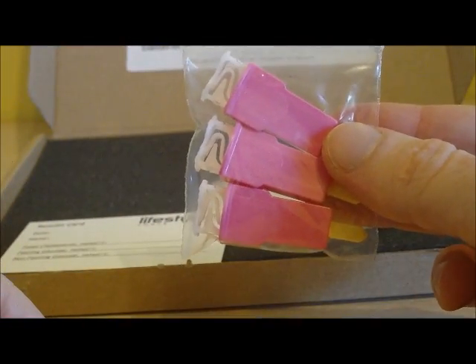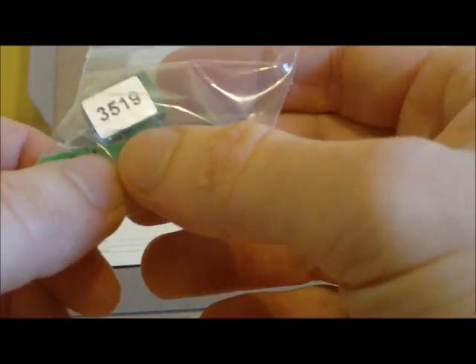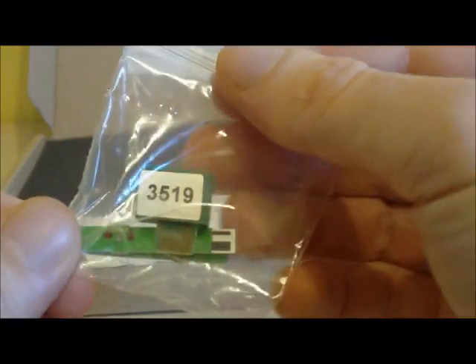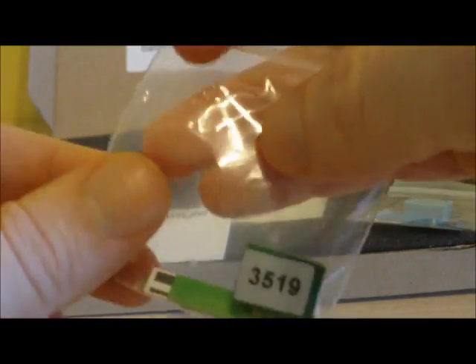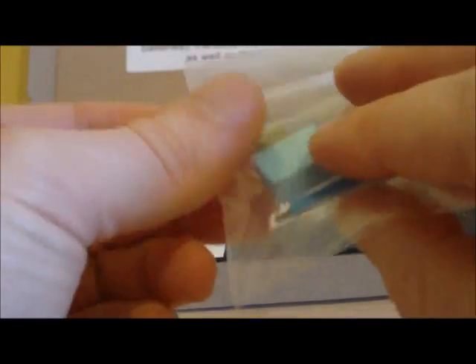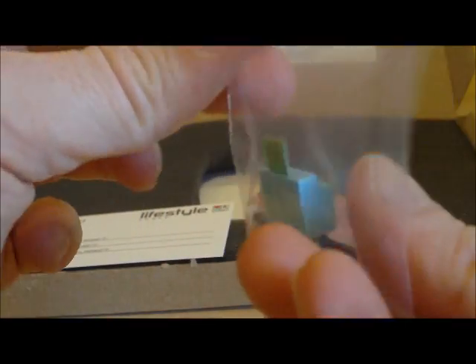You will have three lancets used to prick your finger to get your blood sample. You will have two glucose test strips and a glucose code key, which are coloured green. You will also have a cholesterol test strip and cholesterol code key, which is coloured blue. You may have ordered additional test strips, in which case you will have extra in the bags provided.